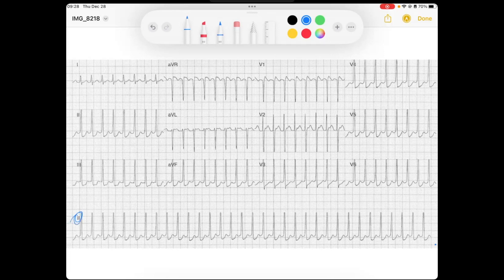We've got a narrow complex QRS that is very regular and absolutely tacking away. Finding a QRS that lands on a solid line, let's count off that rate: 300, 150 — probably around 200 beats per minute.